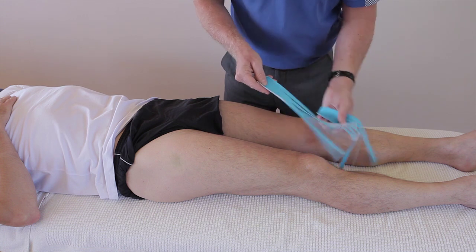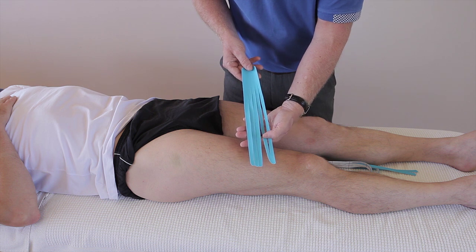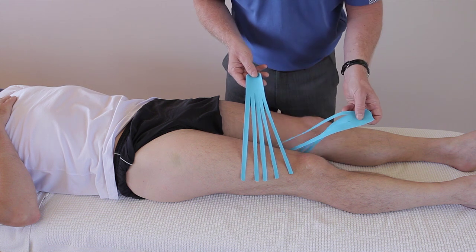In this case we've prepared an eye strip slightly longer and actually cut five individual fingers, and we've done that twice.